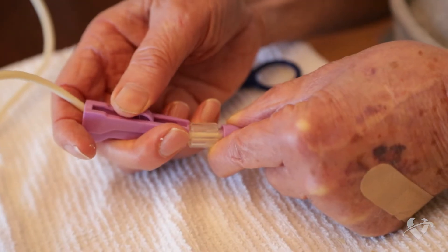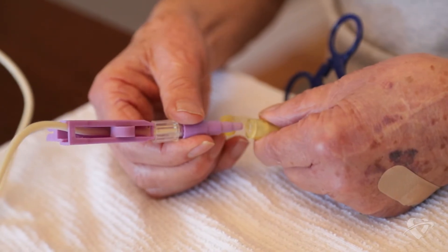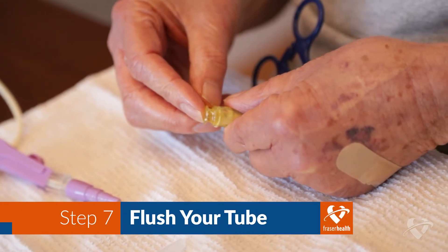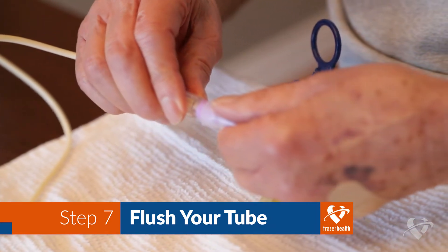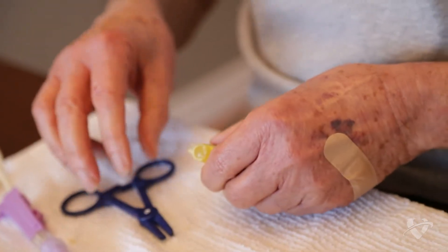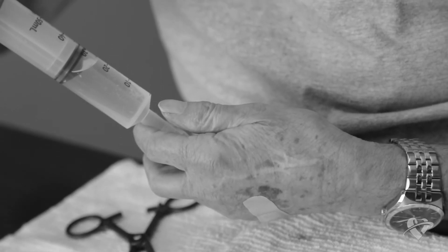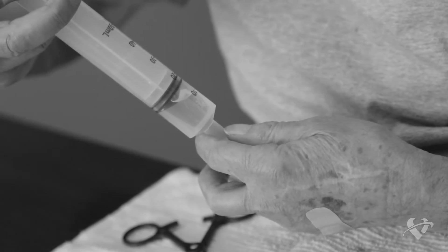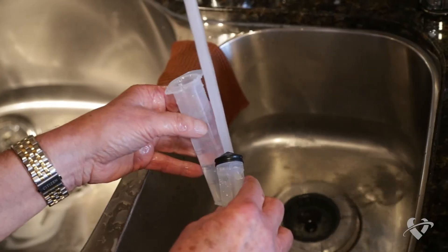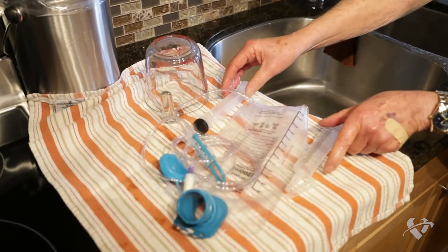When your feeding is complete, clamp or pinch your g-tube. Disconnect the feeding bag tube and cap your feeding port. The final step is to flush your g-tube once more to clear it of all the formula. This will help prevent a blockage. Follow the same steps as you did to flush your g-tube before you started feeding. Your feeding is now complete. All that is left to do is clean and put away your supplies and remain upright for at least 30 minutes.